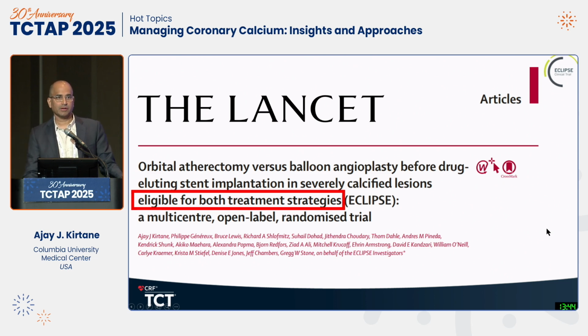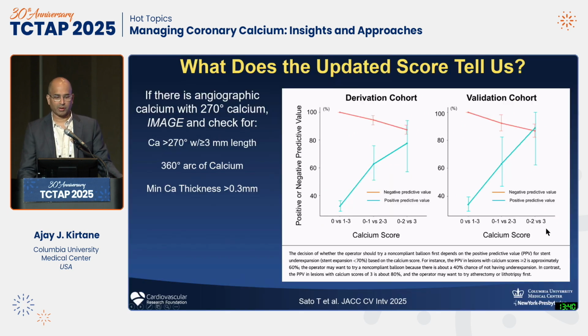So despite the fact that there's no true clinical outcomes data, it's very important to mention that atherectomy still has a role. So what is the data in imaging, where does it stand right now? Because the CT data that you showed in the prior two talks is interesting, but it's not in prime time use yet, but intravascular imaging is.